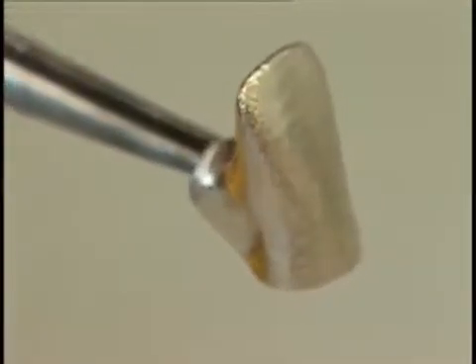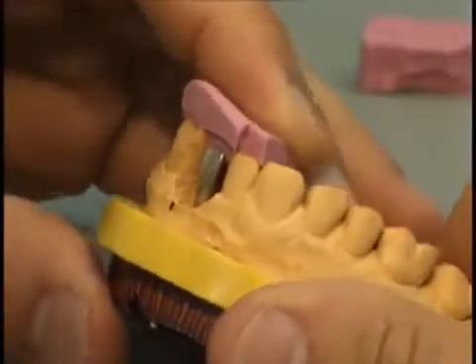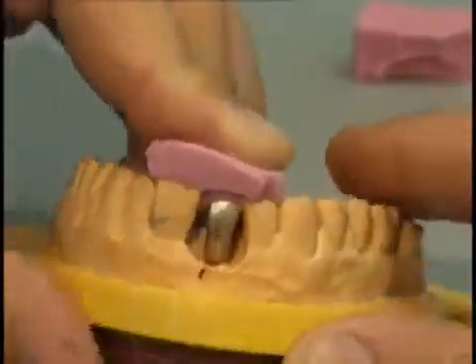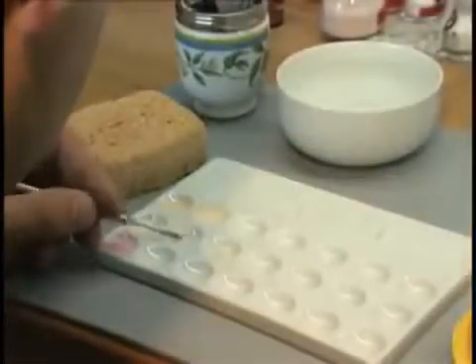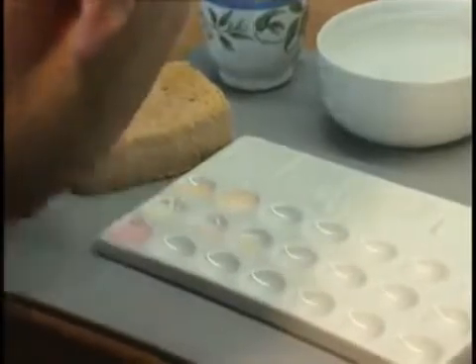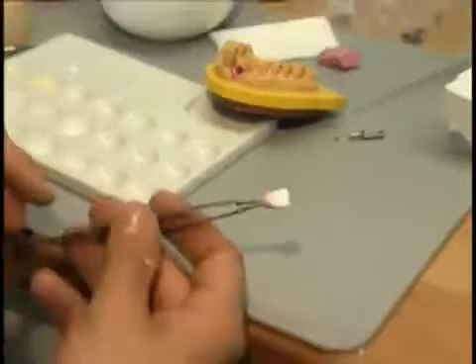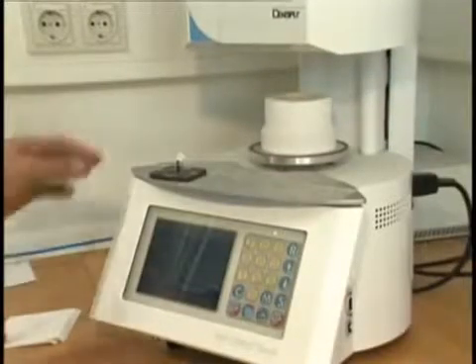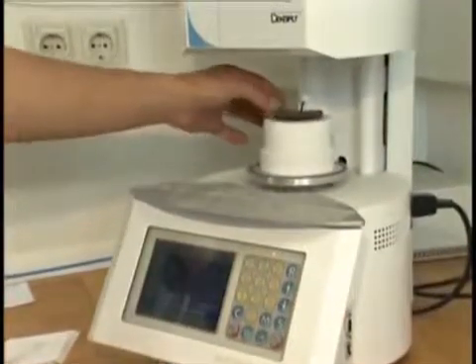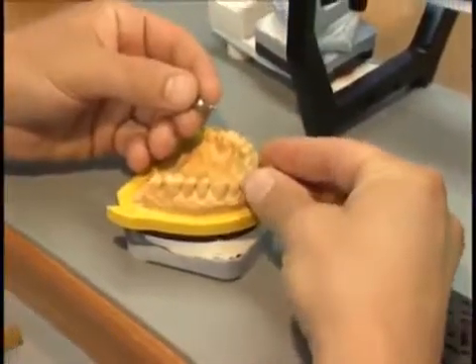The construction can be placed on the working cast without any tension at all. The interocclusal space is sufficient as well. The casting is veneered with ceramic material following anatomical guidelines. The completed crown is first retained on the working cast with the transversal screw, and the occlusion and articulation are checked.